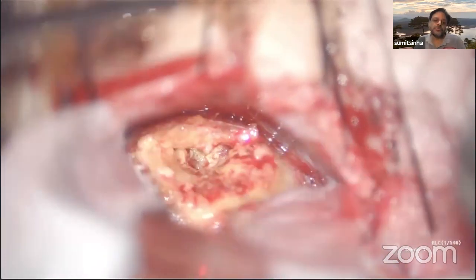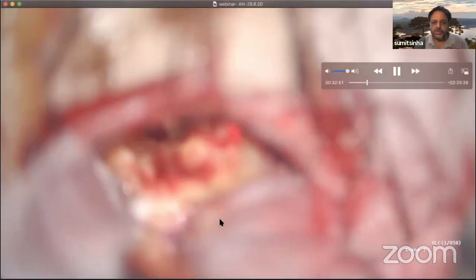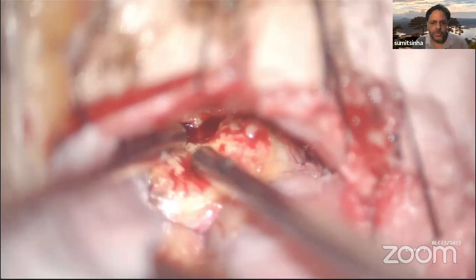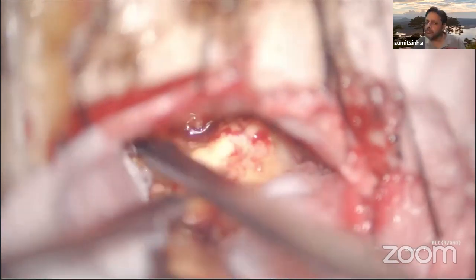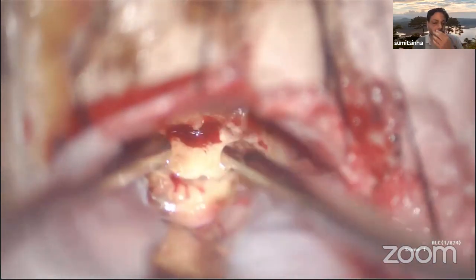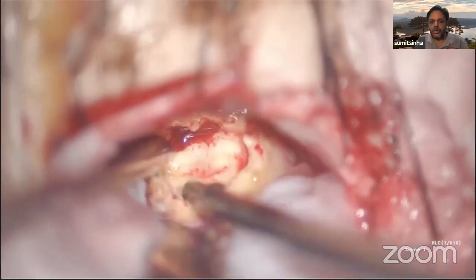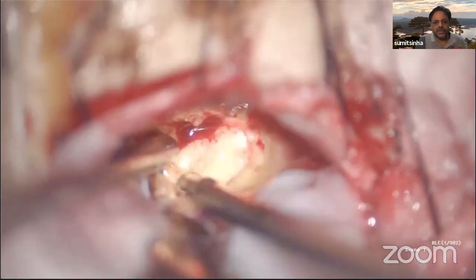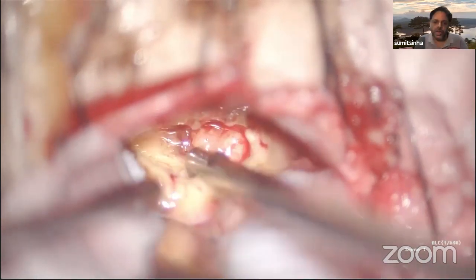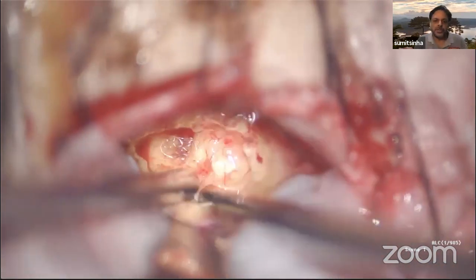So, coagulating the bleeding points and then using your CUSA. And the next step is to use your CUSA and then suck away the tumor. Now, if you have a CUSA, well, it's good. It is not, of course, mandatory to remove the acoustic tumor. You can remove the acoustic tumor even without a CUSA, but if you have it, it is a bonus. So depending on the consistency of the tumor, the CUSA settings are kept at half or three-quarters. Initially, to start with, I keep it at 75% or maybe 100% in such types of easily suckable tumors.